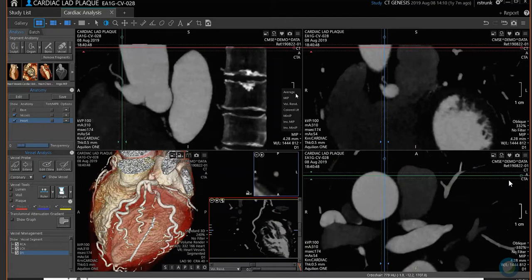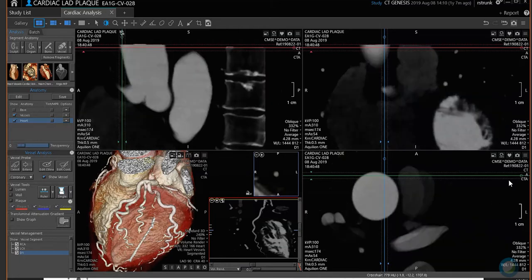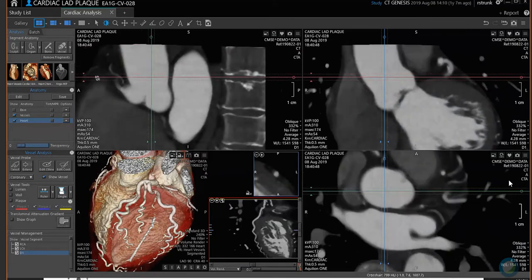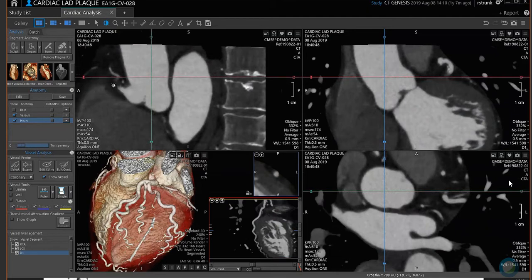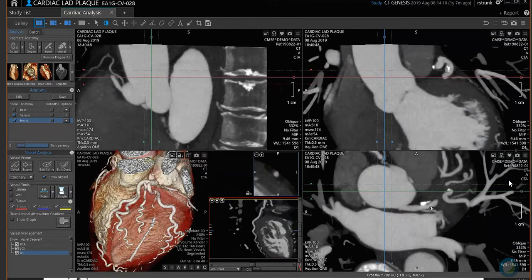Average is used for a non-MIP viewing mode. Average is only used if your slice thickness is 1mm or less — if you hit Average, you'll see it's kind of blurry.